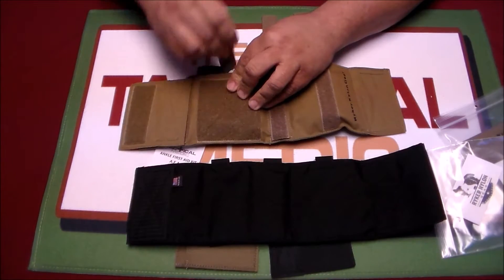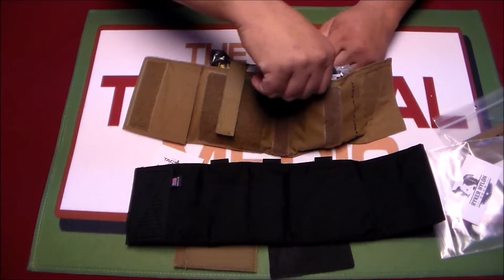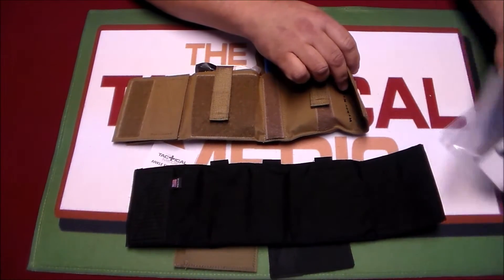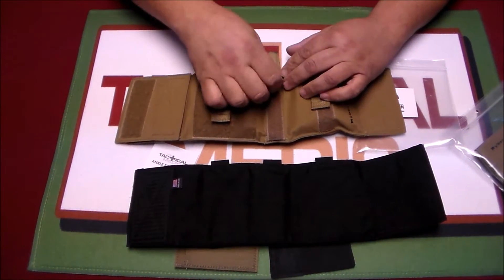We feel that this kit gives you what you need to deal with gunshot-type wounds or any kind of penetrating injuries. Granted, as with any medical products, compromises are made for size and ease of use.